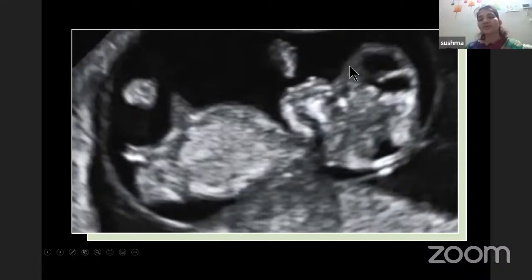Now coming to holoprosencephaly, holoprosencephaly is not a diagnosis that we make in the sagittal section. Okay, so this is anencephaly. The finding that we see here is the abnormal protrusion of the brain structure because of the absence of the calvarium. So anencephaly is the right answer for this. We'll move on to the next slide.